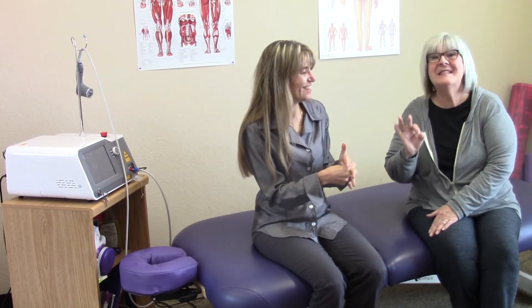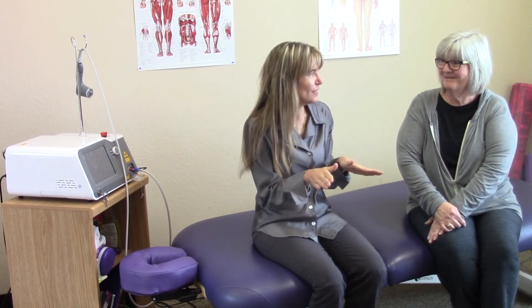Zero pain. So she had zero pain after one treatment. This isn't always the case, but the laser works tremendously well on scar tissue, and this was a relatively new injury — she sustained the cut about six months ago. She had had a couple months of therapy, was getting gradually better, but we did one laser treatment, and she was 100% pain-free.